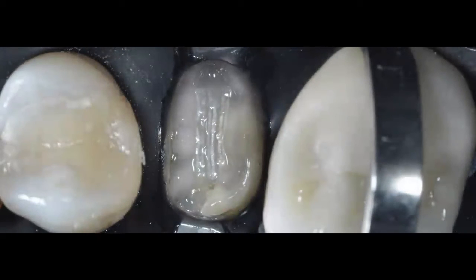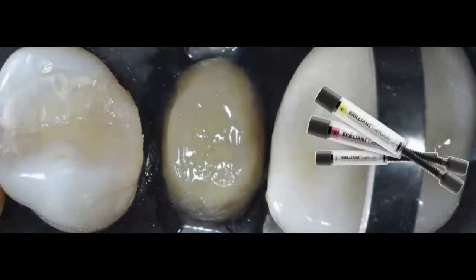And this is what it would look like. You can see that I've been pushing my fiber within that bed of a combination of flowable and nano hybrid composite, both Brilliant Everglow. I'm pushing that fiber with that micro brush. And once I feel that I'm happy and everything is nice and uniform, I go ahead and I light cure. When I light cure, again, just to remind you, I know that my 4 minutes have gone by and my timer, which I use, has already rang its little bell. So now I'm ready for the next step.